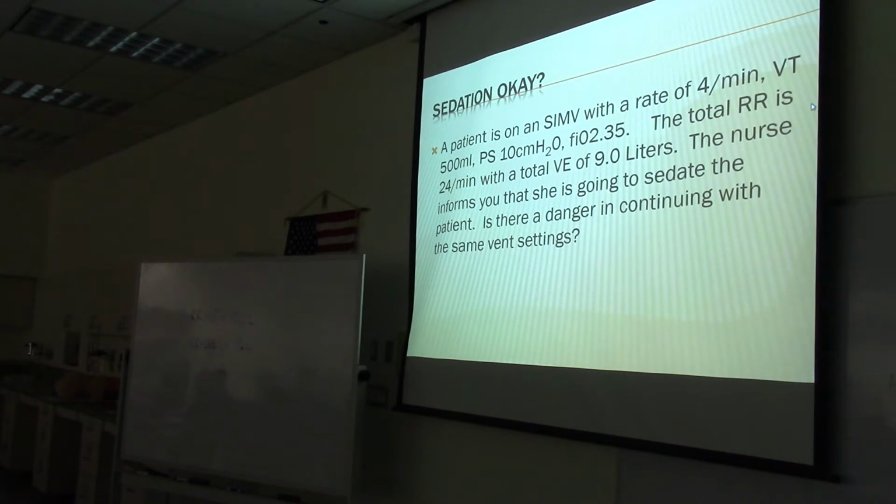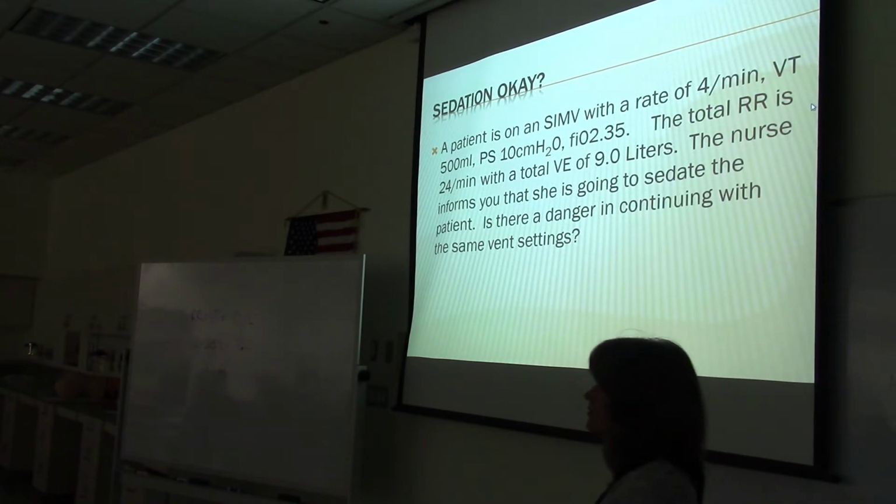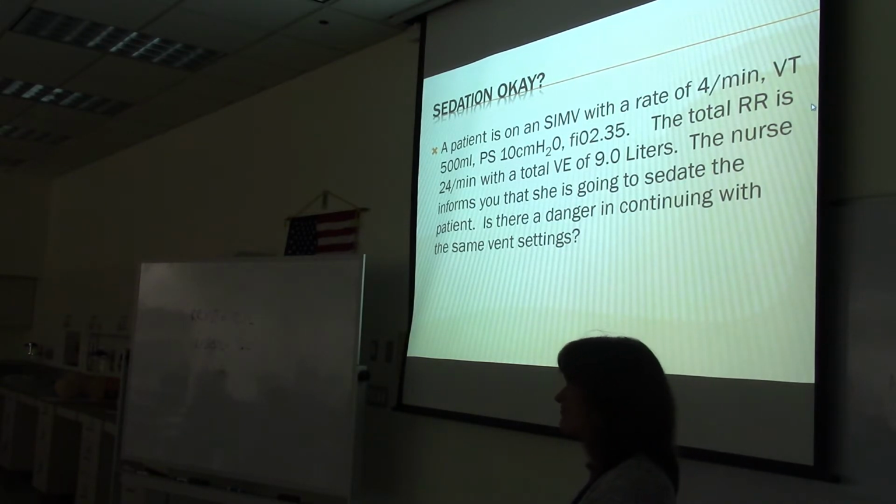Because he's on SIMV with a rate of 4, if she's going to sedate him, you have to increase the rate or put him on full support, depending.